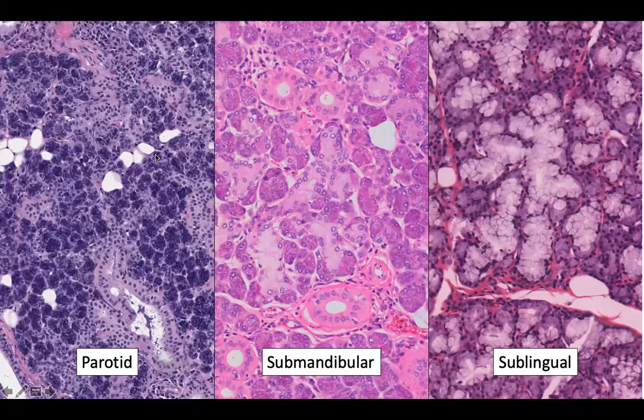It's a dumb, easy pimping question, but parotid gland is almost all serous type cells, which means they're these cells with these zymogen granules, which we use to digest our food. So all these purple zymogen granules here. By the way, these are intercalated ducts. There's another intercalated duct there, and here's a striated duct, just so you can appreciate again in another picture, intercalated duct here.